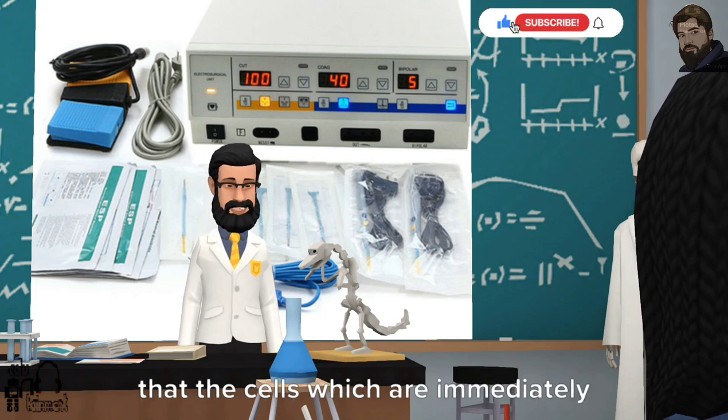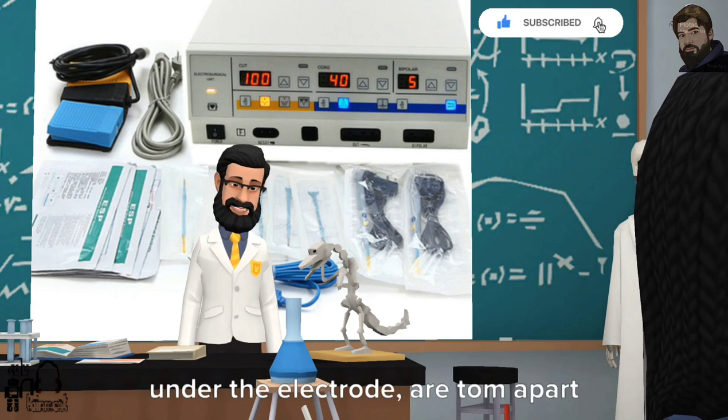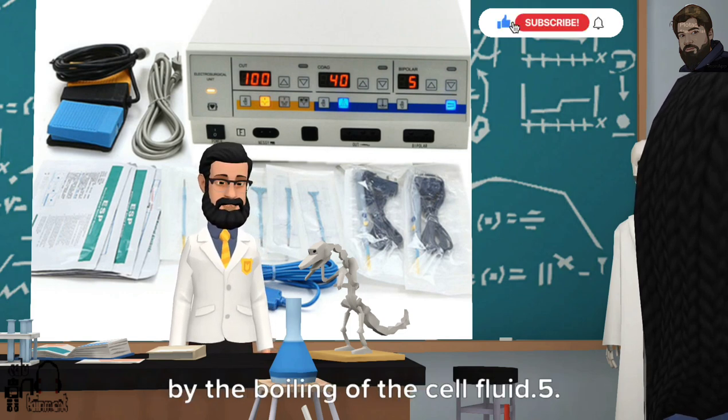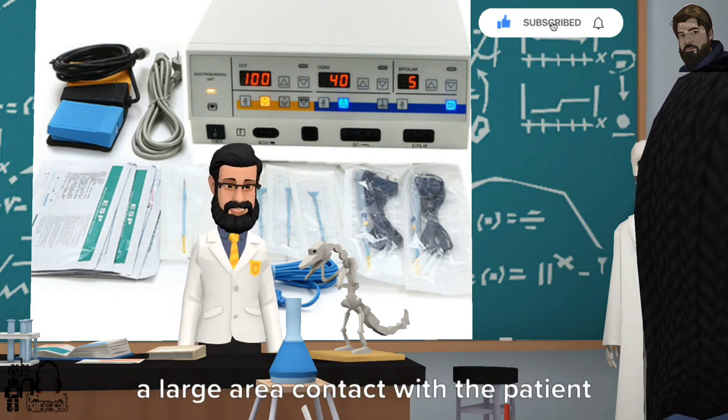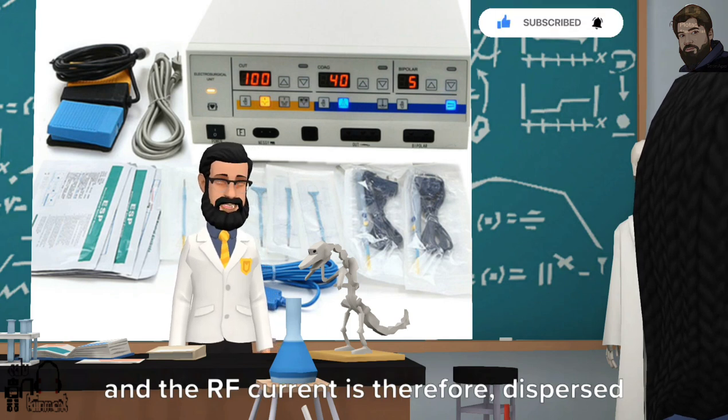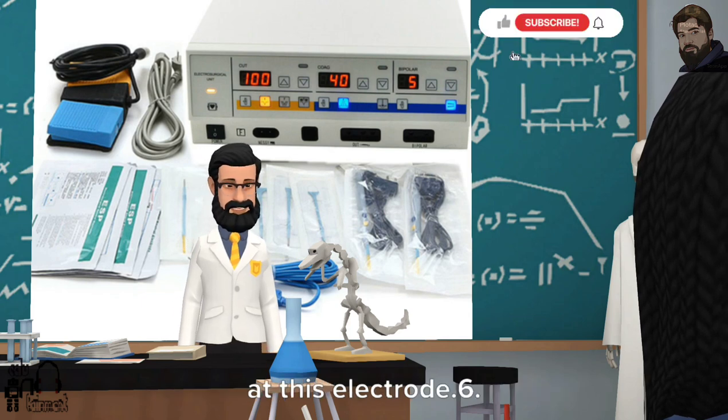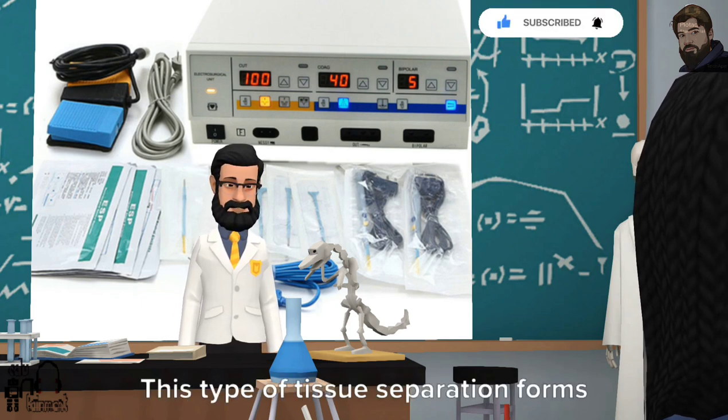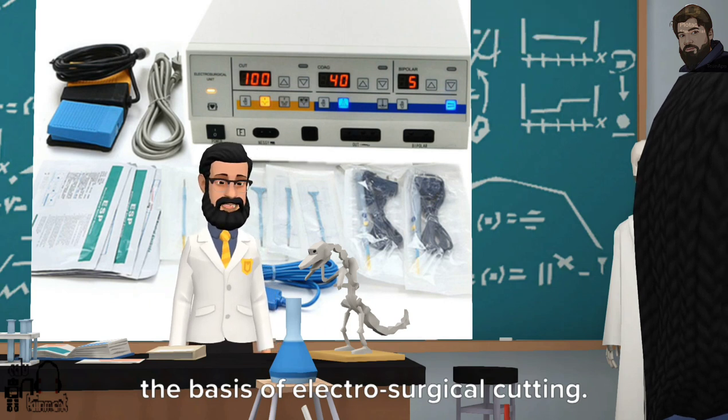The tissue is heated to such an extent that the cells which are immediately under the electrode are torn apart by the boiling of the cell fluid. The indifferent electrode establishes a large area contact with the patient and the RF current is therefore dispersed so that very little heat is developed at this electrode. This type of tissue separation forms the basis of electrosurgical cutting.